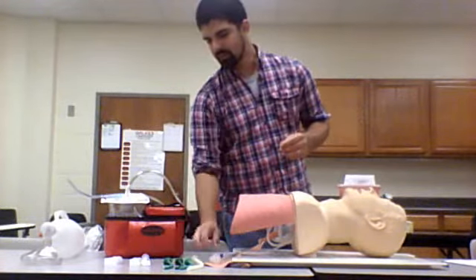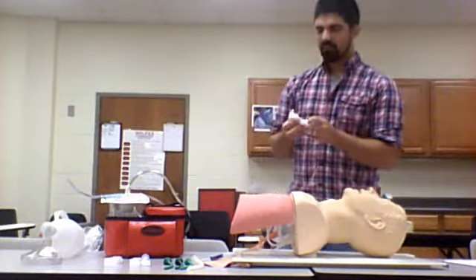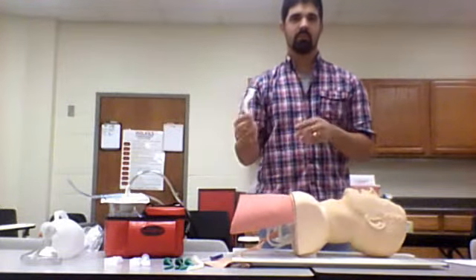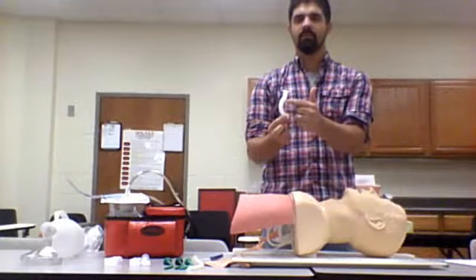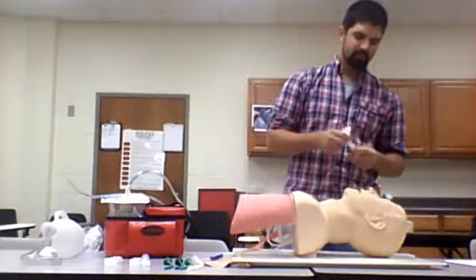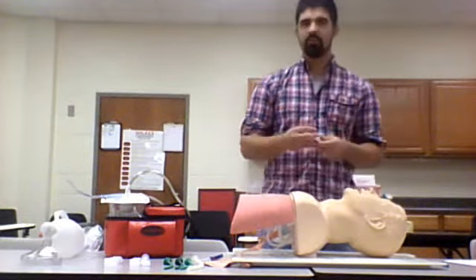Another option for an airway adjunct would be an OPA, or an oropharyngeal airway. These OPAs are harder plastic. They're used in the oral airway in the mouth. You can see here it's got a little bit of a crook to it. We'll go over that in a minute, but that'll go into the mouth.